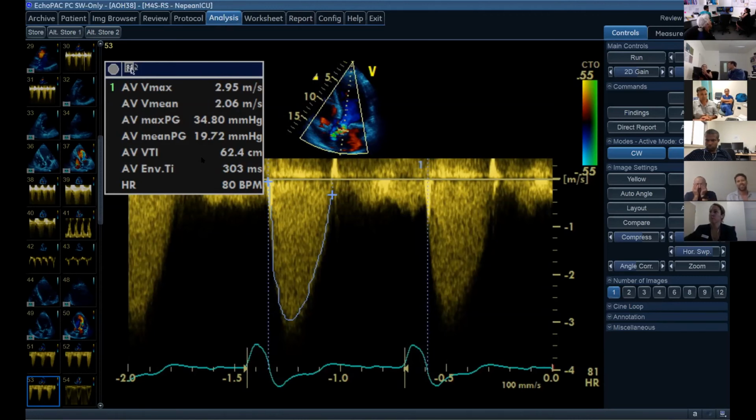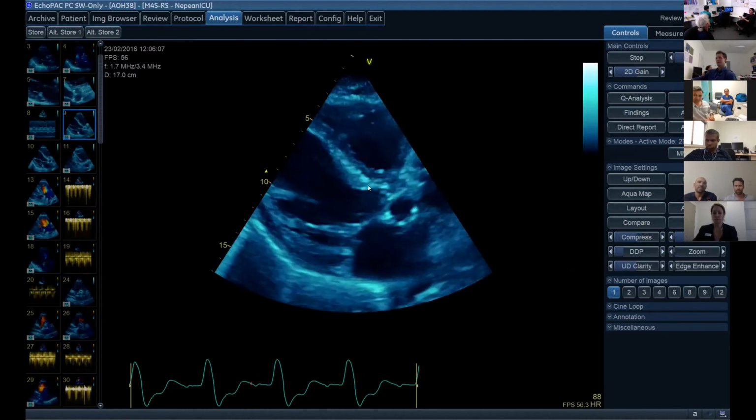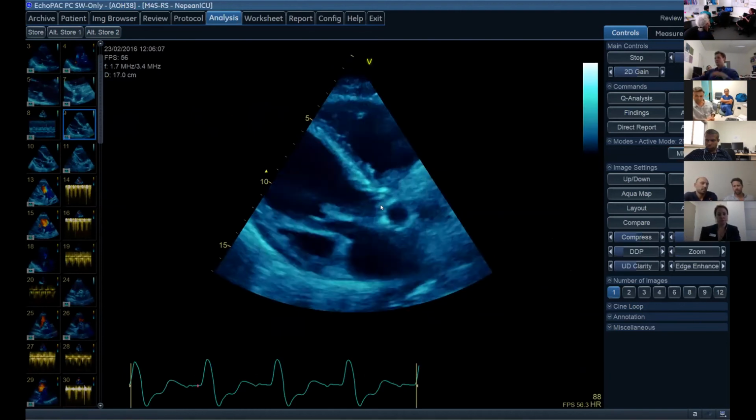I think it's the other way around. Like, you can't use it for grading mitral stenosis if you have aortic regurg. Absolutely, I completely agree with that. But wouldn't you say the same thing with the other? Could you? Because it should be the same stroke volume going through the LVOT. During systole, some of that blood might go back through the mitral. Yeah. But then the problem with that is it's only the blood going through the LVOT that goes through the aortic valve.